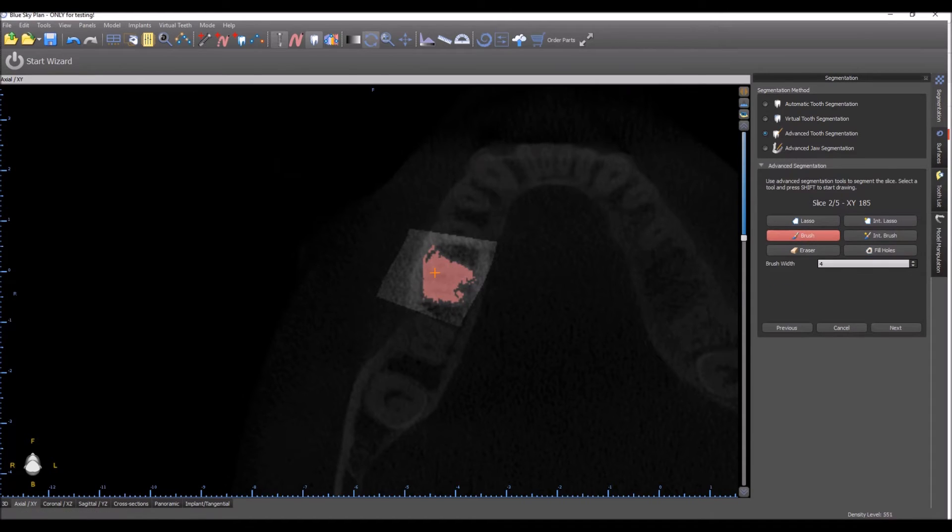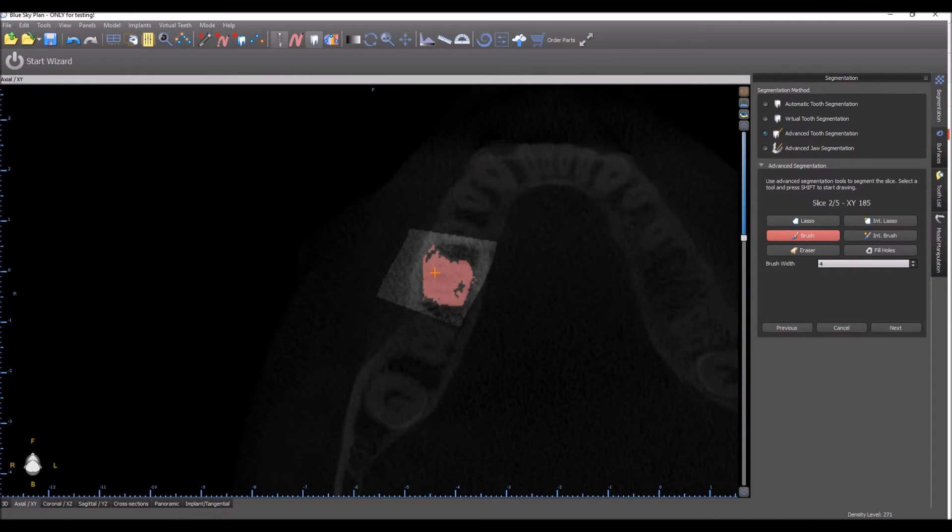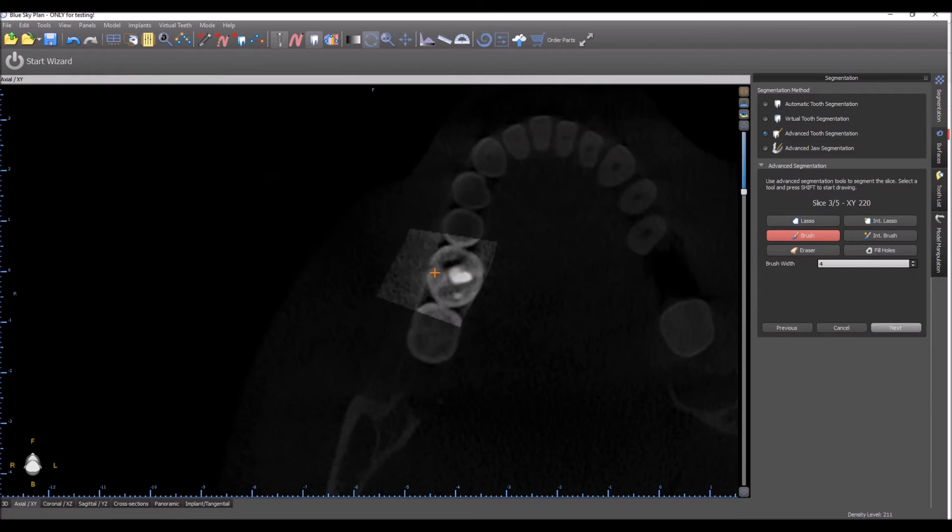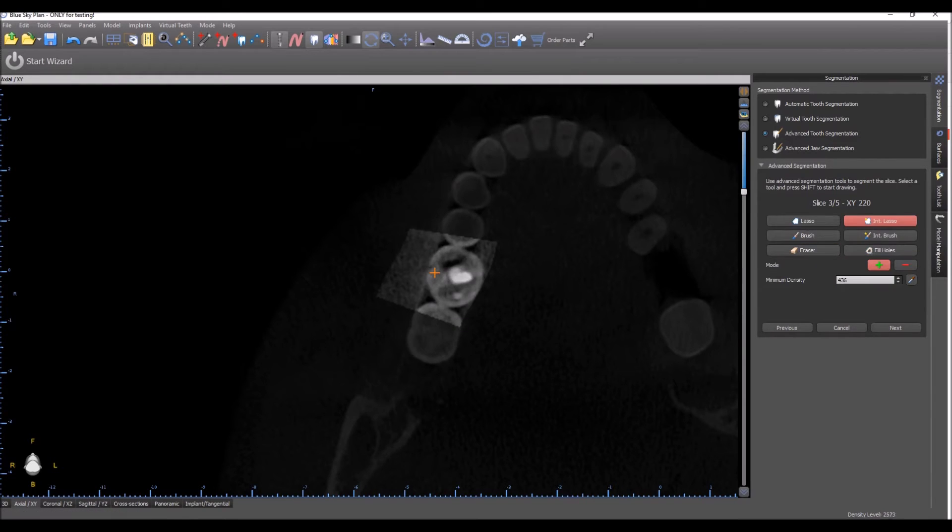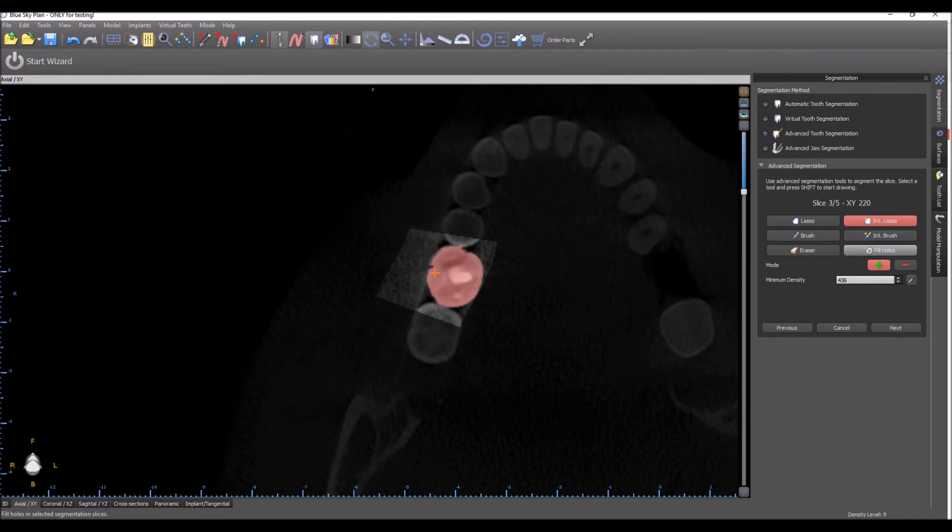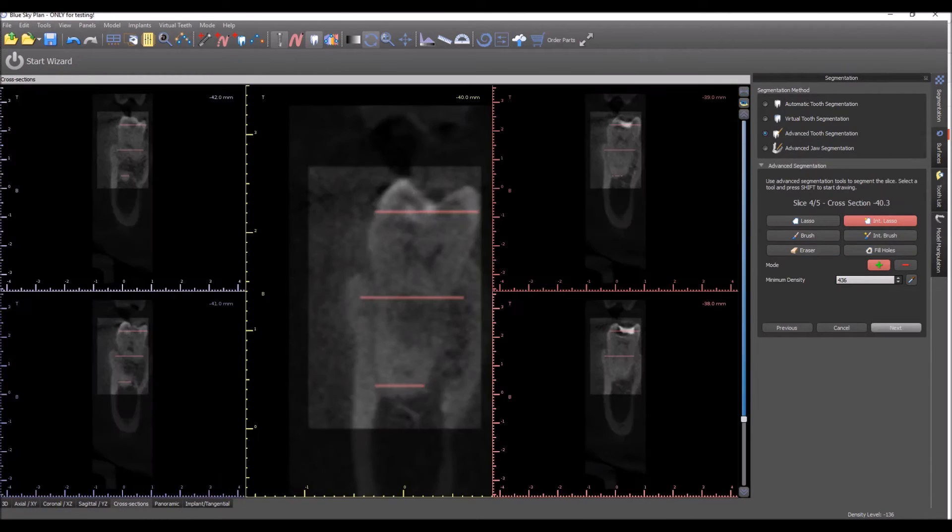We'll use the Brush tool here also to fill in some parts that are below the density threshold. We'll use Fill Holes again and go on to Next.